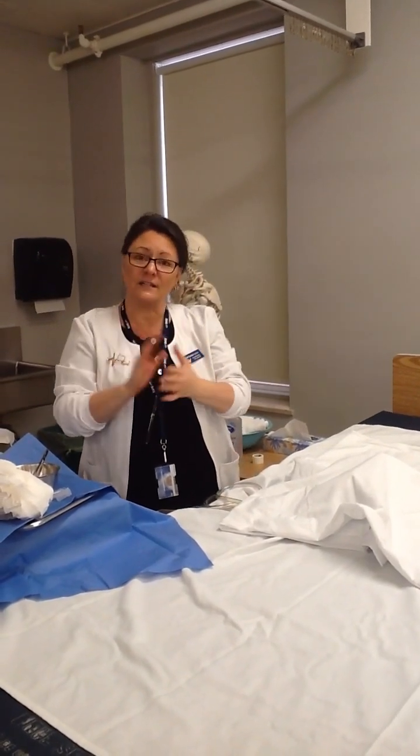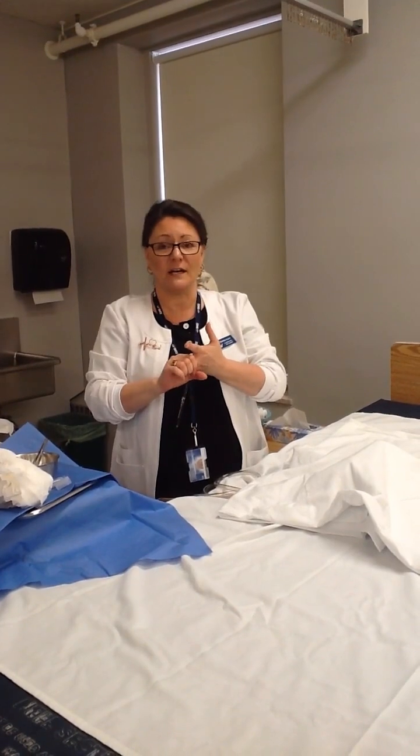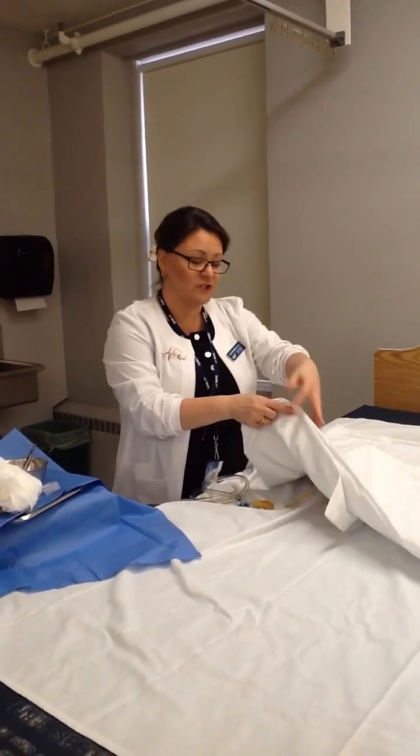And then I would want to document everything that I did. So starting with the size of the catheter, the type of catheter, the amount of sterile water that I inserted into the balloon, how much urine the patient had in their bladder, how the patient tolerated the procedure, all the characteristics of the urine, and I would initiate an in and out sheet to monitor and keep track that my patient is outputting enough urine and inputting enough fluid as well, depending on the nature of your patient's care. And I think that's everything.